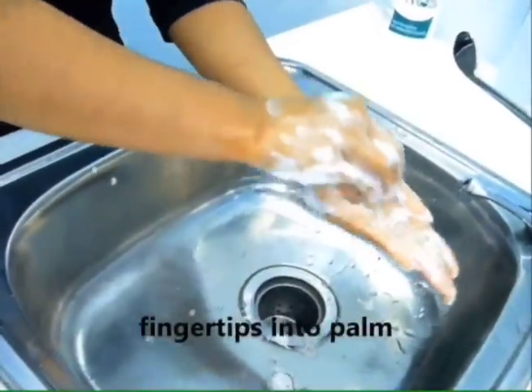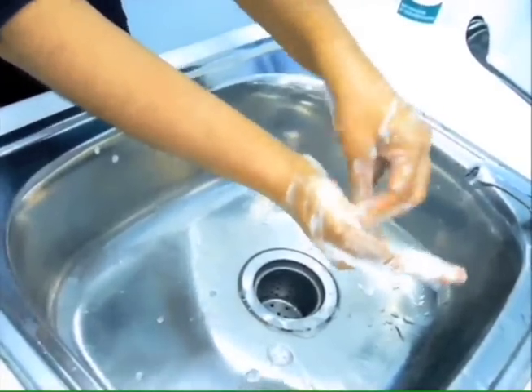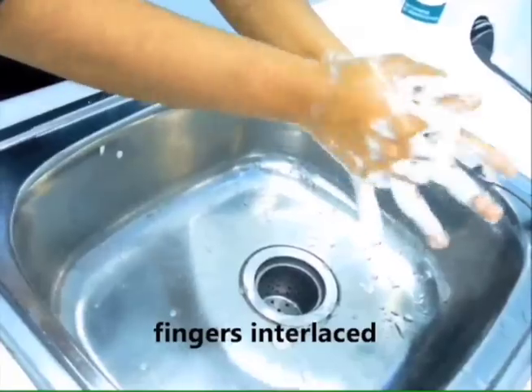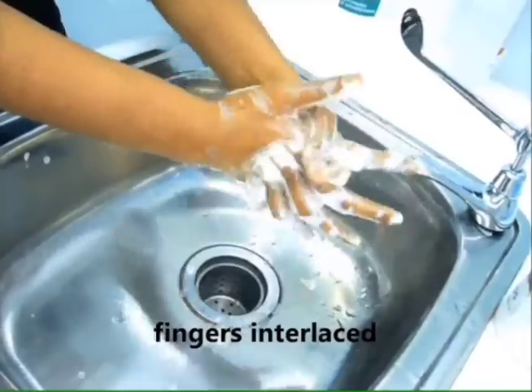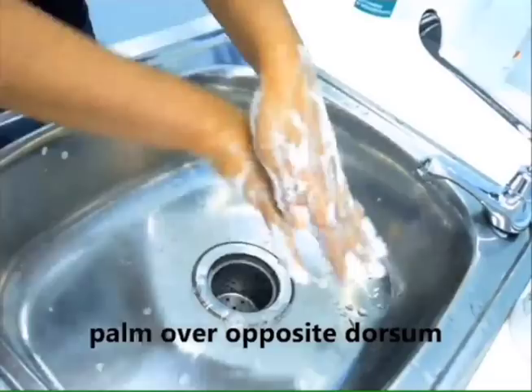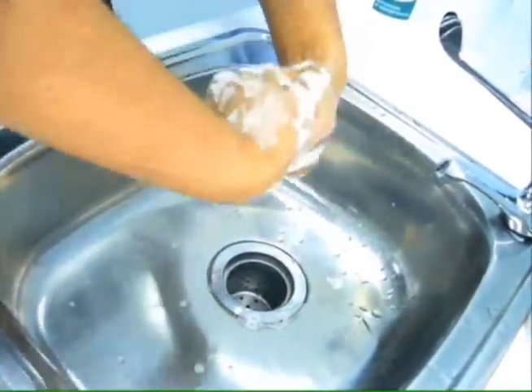Scrub fingertips into palm, and repeat for the other hand. Scrub palm to palm. Scrub in between fingers while keeping them interlaced.